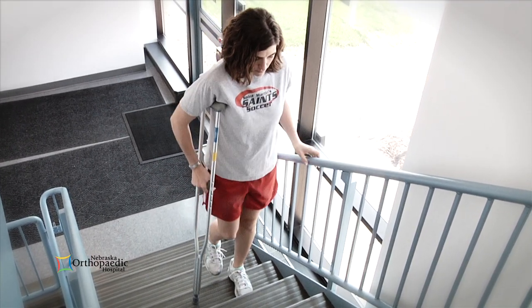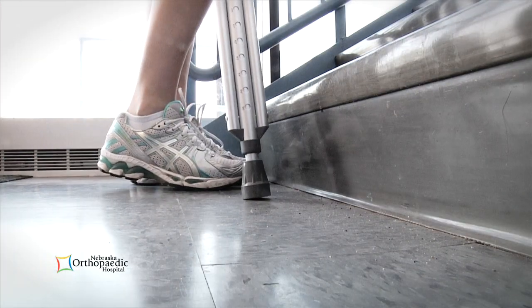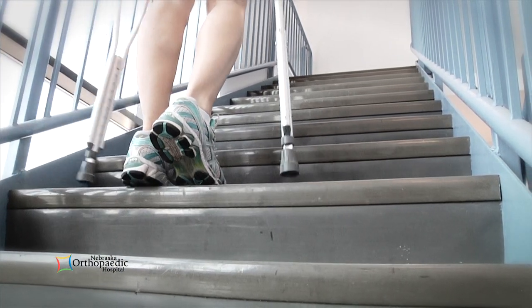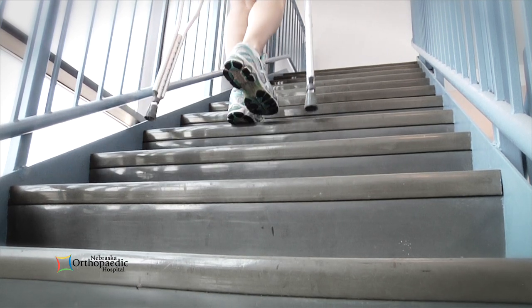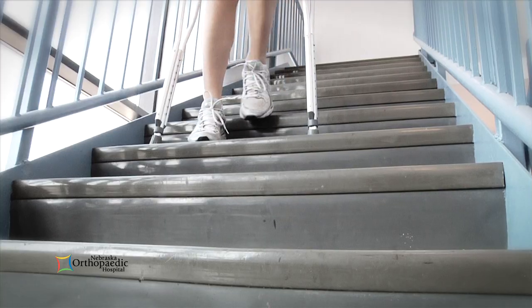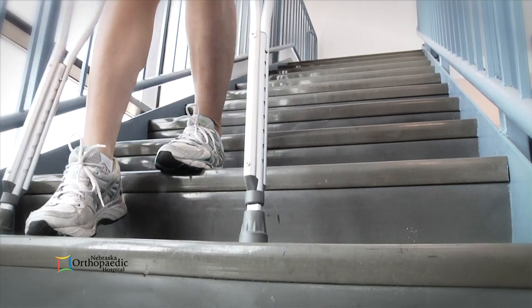To go up the stairs, align yourself closely to the stairs. Start by placing your good leg on the first step. Push through the good leg to bring your body upright, stepping next with the operated leg and crutches last. To go down, place the crutch or both crutches on the step below you. Step down leading with the operated or injured leg and follow with the good leg.